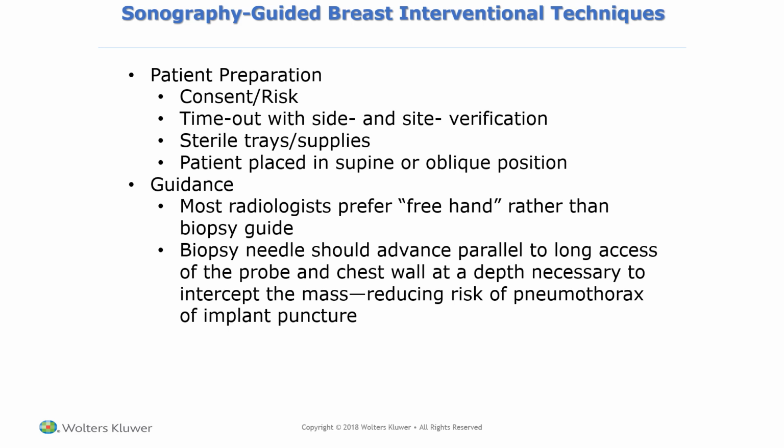So guidance is going to vary depending on the physician that you're assisting. Most radiologists will really prefer to freehand these, meaning that they're not going to use a biopsy guide. We looked at those biopsy guides in class, where it was that plastic clip on your transducer, and they would simply advance the needle down the clip. Most radiologists will not use those, and they will simply freehand or scan while they insert the needle, watching the needle as they go. The biopsy needle can either be inserted across the transverse face of the transducer or in long with the transducer, and the appearance of the two different approaches is going to be very different.